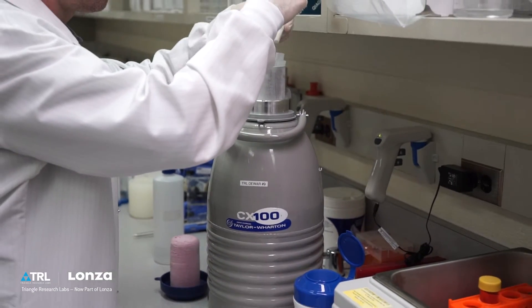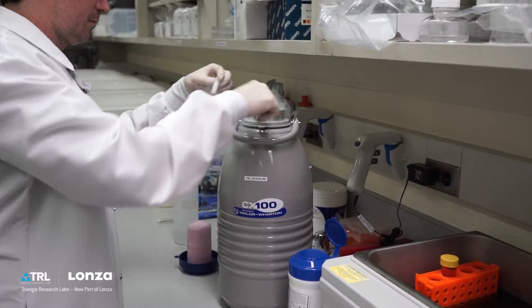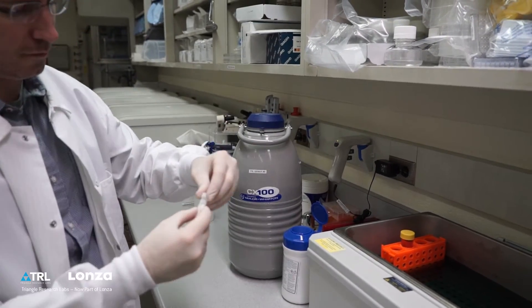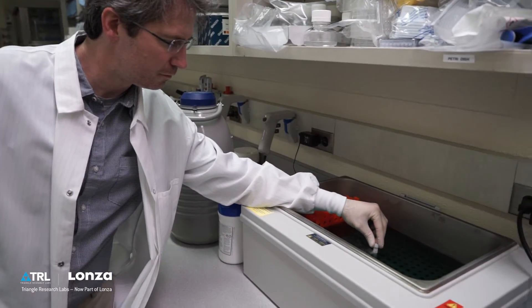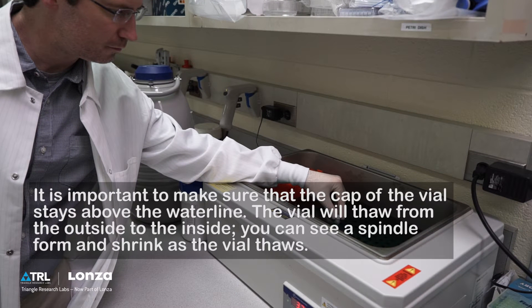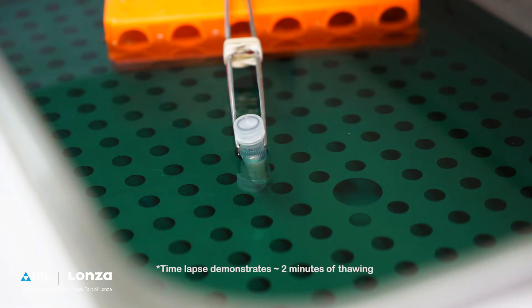Quickly remove the cryopreserved hepatocytes from their storage location. In the water bath, vertically submerge as much of the vial as possible up to the cap. It is important to make sure that the cap of the vial stays above the waterline to prevent possible contamination. Thaw the vial for 90 to 120 seconds. The vial will thaw from the outside to the inside, forming a spindle. Ideally, a thin ice spindle should remain.